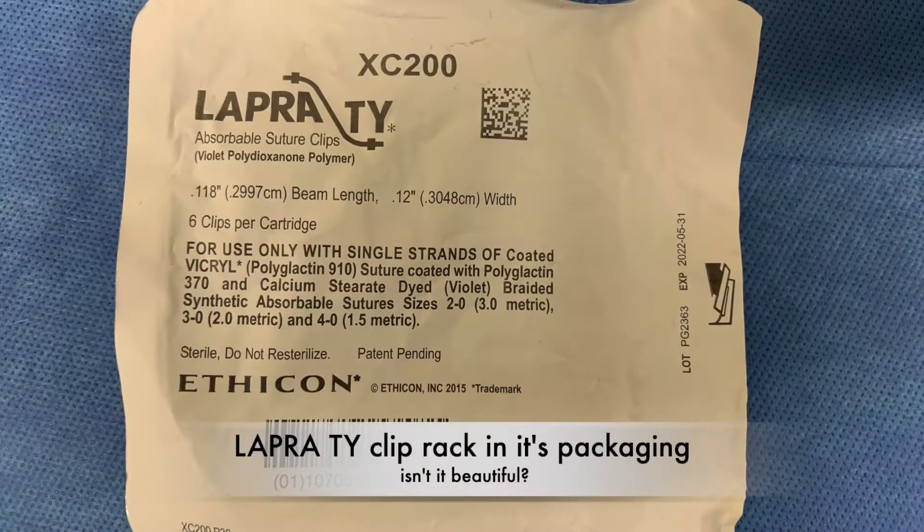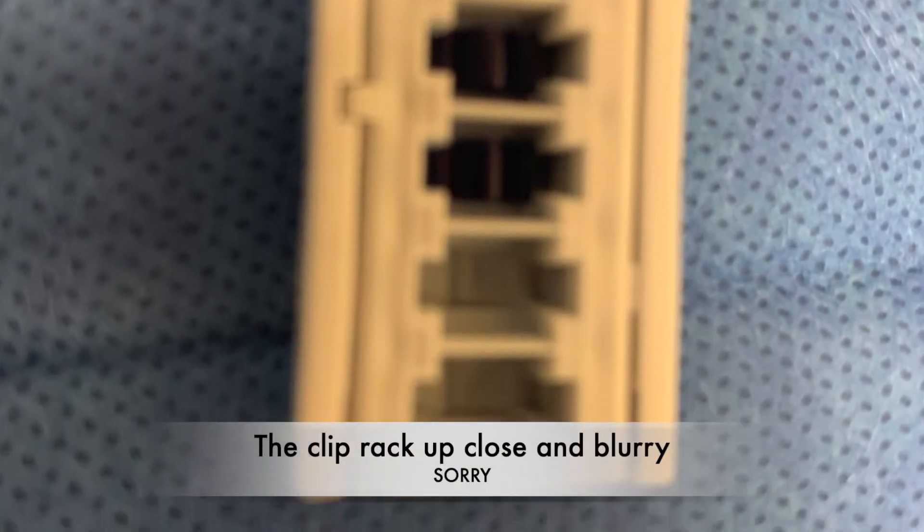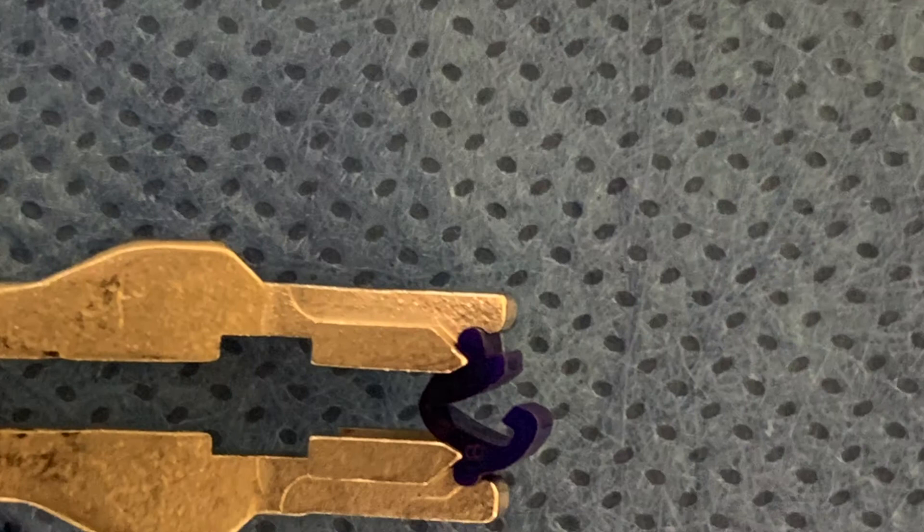Hi, this is Tying Lapra Ties. How you do this is entirely up to you, as long as your end product is exactly what you need. This is just my preferred method.